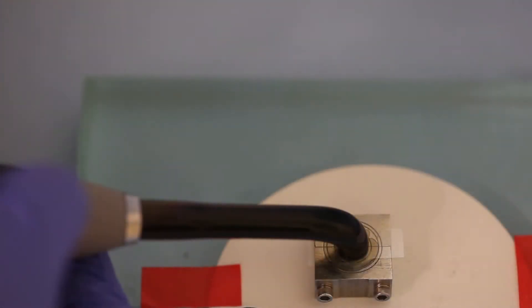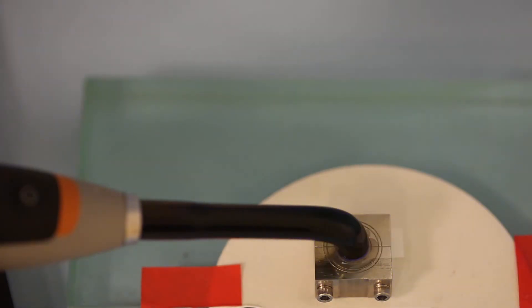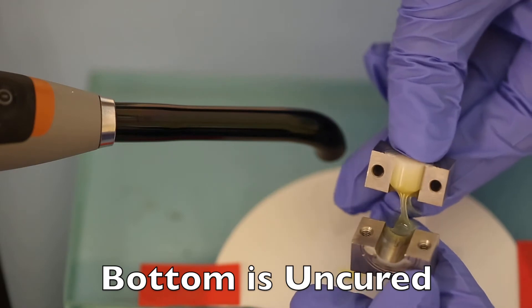Now we're going to cure the same composite using 10 seconds with the Power Cure. The first thing you'll notice is that 10 seconds seems a lot longer than 1 second. When we open the mold, again the bottom of the composite is uncured, but it is 10mm in depth. We'll dissolve away the uncured composite.